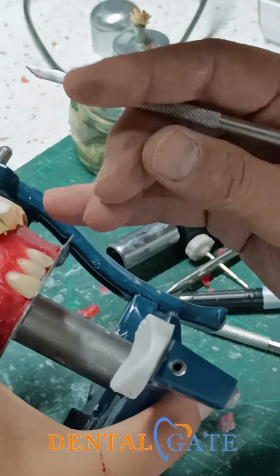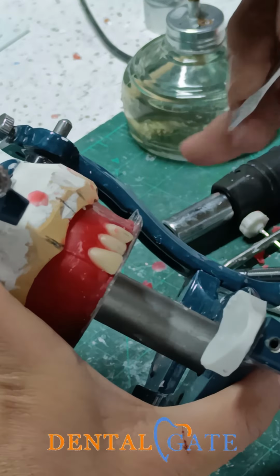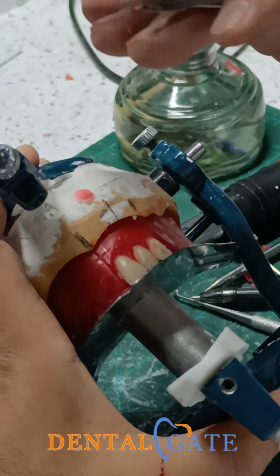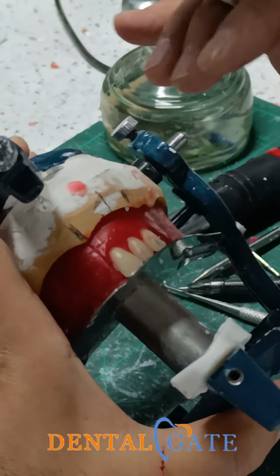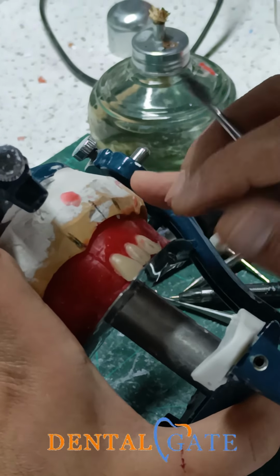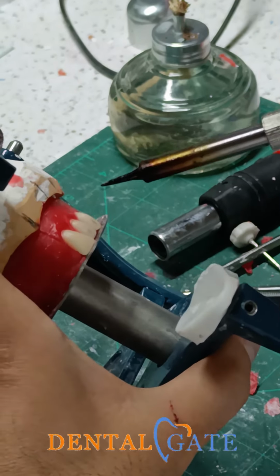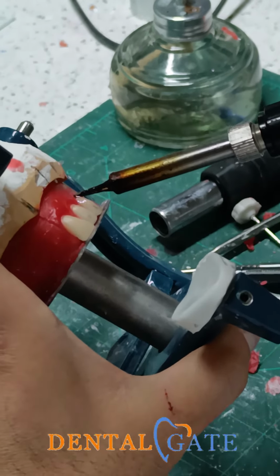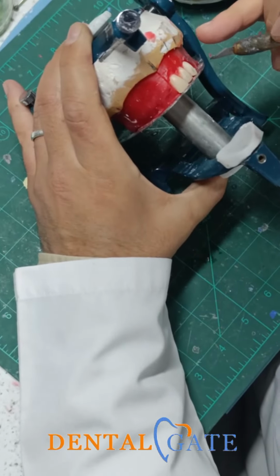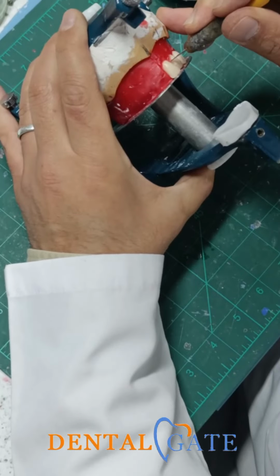Okay? Now, make sure there is a contact here. The contact, it should what? It will be decreased in the level toward the middle third now. Okay, this is the main criteria for the central and lateral, the anterior teeth, and for one side, the central and lateral as well as the canine.